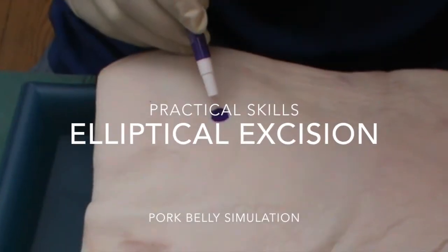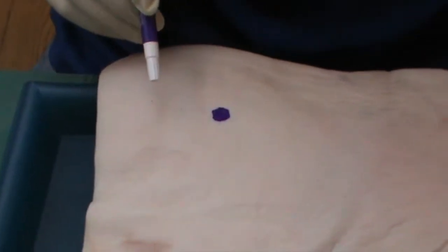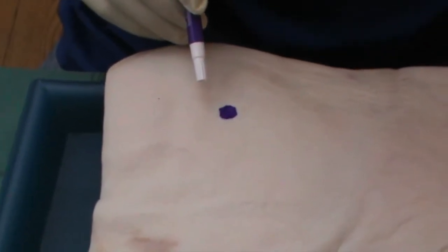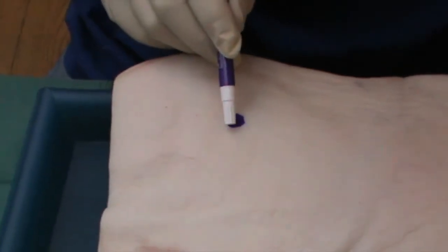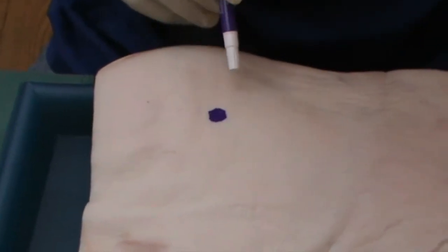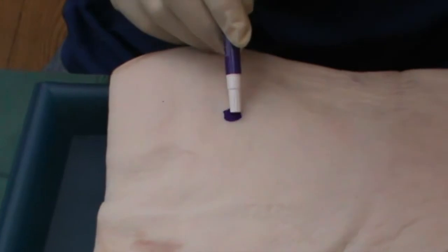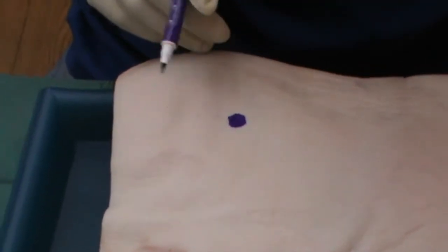When we come to taking out a lesion, a simple elliptical excision, the usual rule is that we want to have a three to one excision. That's three times the length to the width of the excision. Here we have what is purporting to be a nevus.